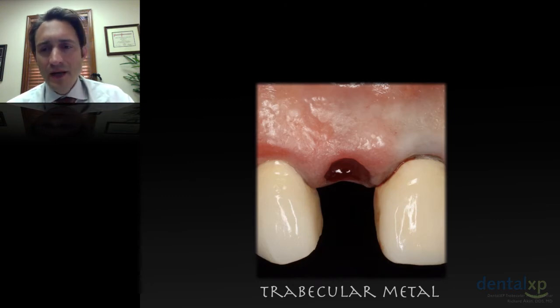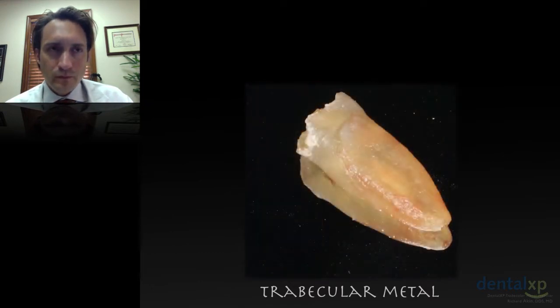This is what I like to see when I take out a tooth in the aesthetic zone, when I'm planning an immediate temporary and immediate implant placement. And here's a root. When I take out these roots, I like to take a look at them, and I like to see where the periodontal ligament was. I like to measure the root. It gives me an idea of depth of implant placement and what to expect from the depth of the socket. And of course, we can compare these to the adjacent roots as to how deep we could go before the nasal floor.